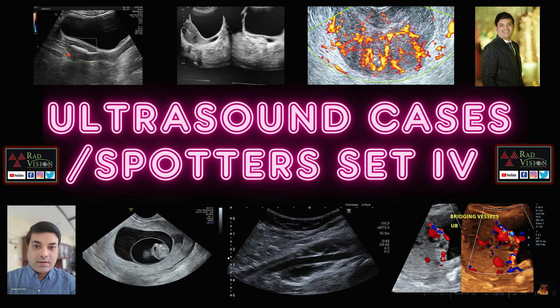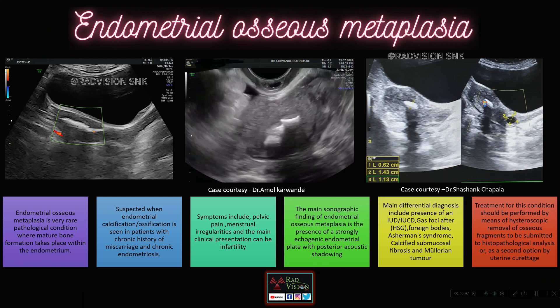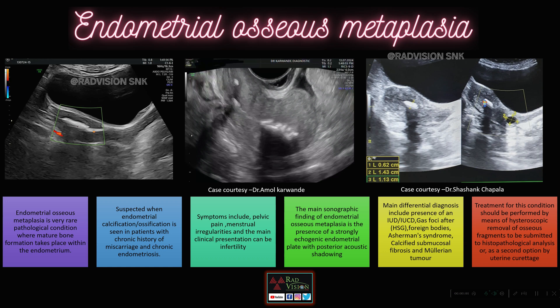Good evening all, welcome to this ultrasound cases and spotters set 4. This is the first case. Here you can see there are dense echogenic calcifications noted in the endometrium, and also here you can see there are dense calcifications and even ossifications in the endometrium with post-acoustic shadowing.